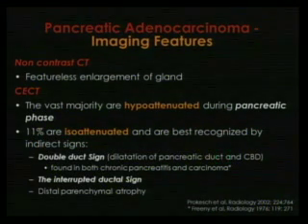Keep in mind that the double duct sign, described by Patrick Freeny years ago, is the dilatation of the biliary and the pancreatic duct, and should be considered a sign of obstruction. Only malignant? No, not only malignant. It can be seen also in chronic pancreatitis. That's why when you see a double duct sign, it doesn't mean that the patient has malignancy, but it is very suspicious for that.